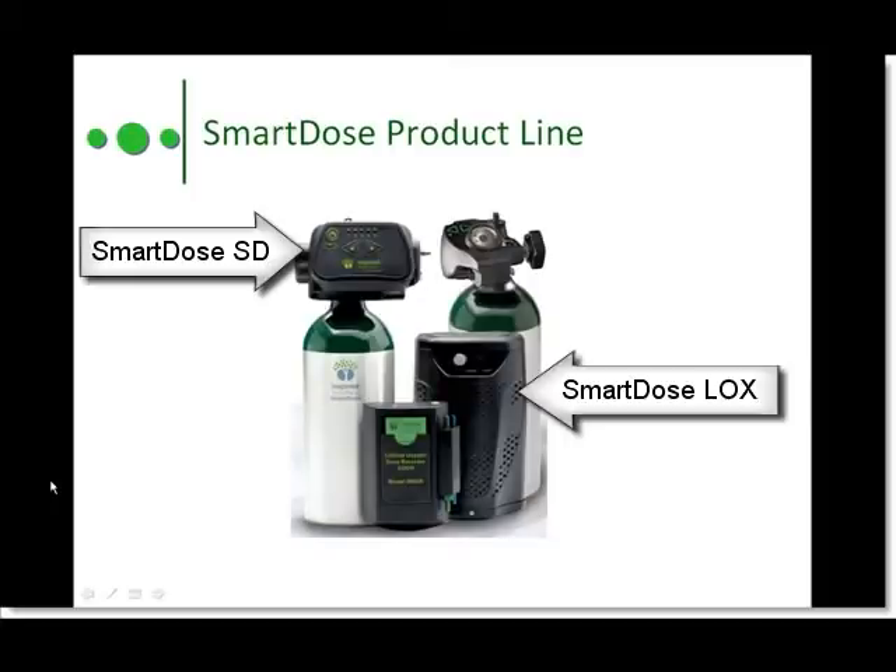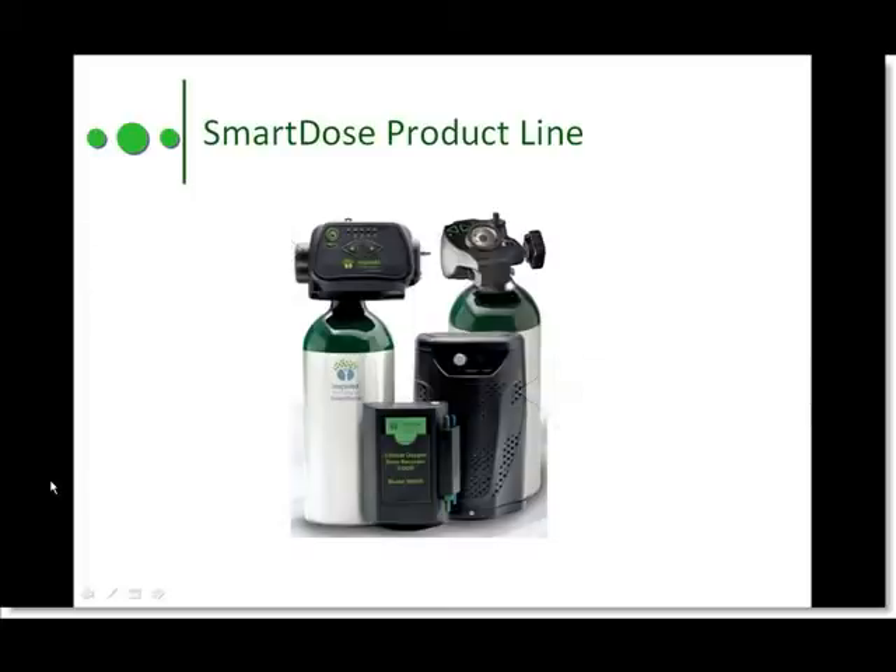SmartDose is very easy to use with minimal interactions. By and large, simply turn it on, attach your cannula, select your setting, and start breathing. So sit back and relax while we run through a quick operational overview.